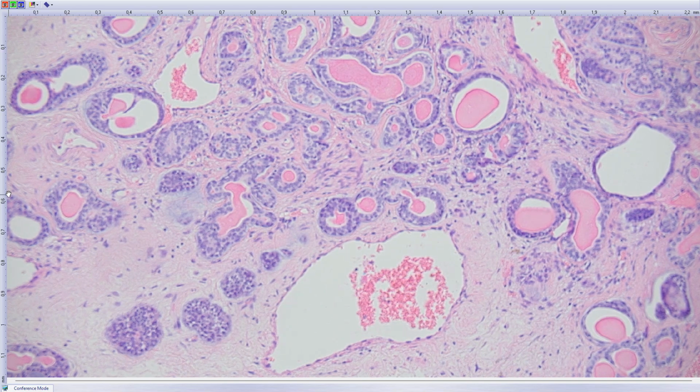Until now, it was recognized that nasal tumors had two types of adenocarcinomas. One of them was that arising from intestinal metaplasia, intestinal adenocarcinoma. The second was called non-intestinal adenocarcinoma, but these are heterogeneous. There are many types of adenocarcinomas. And a big part of them arises by this pathway, that means from seromucinous hamartoma into atypical seromucinous hamartoma into adenocarcinoma.